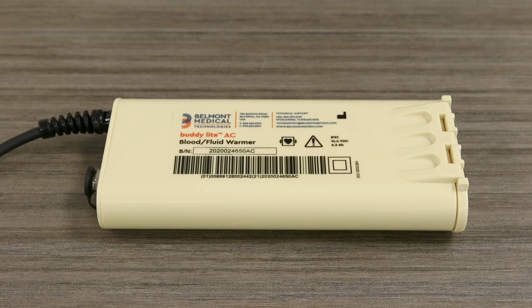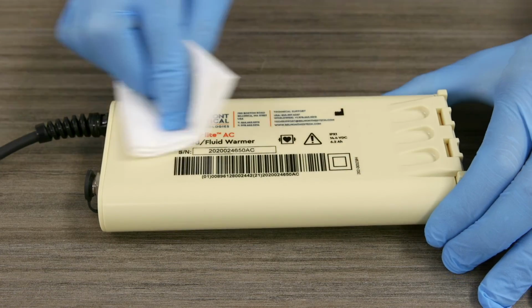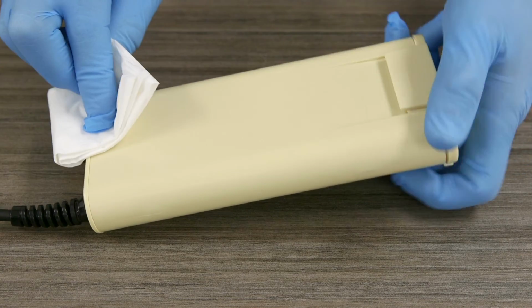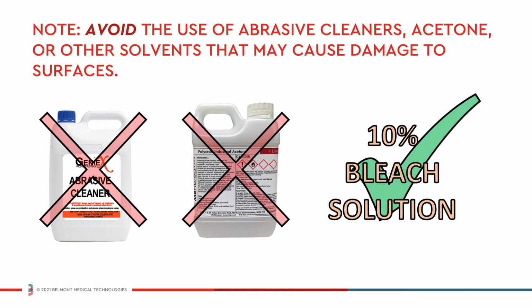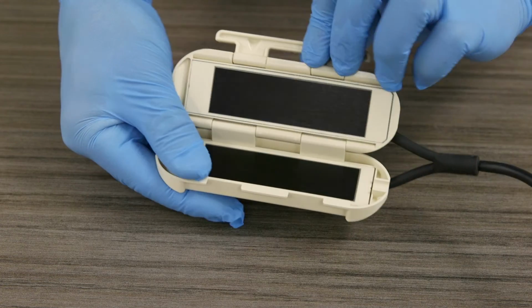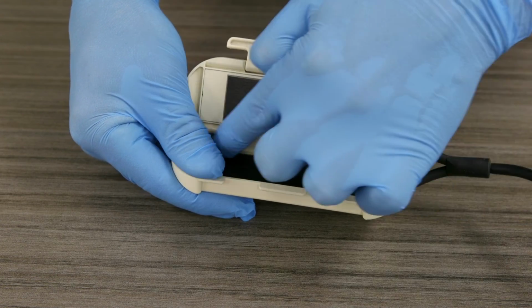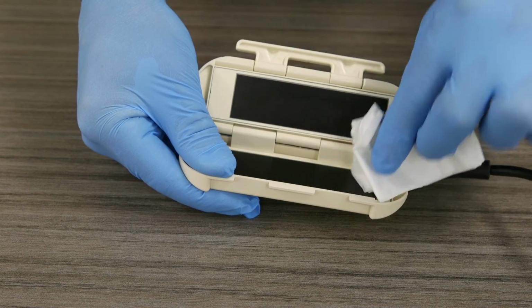Using a soft cloth with water, or with a 10% bleach solution, wipe down the outside surfaces of the battery housing, the power supply, and the heater unit. Note, avoid the use of abrasive cleaners, acetone, or other solvents that may cause damage to these surfaces. Open the heater unit and inspect the seal around the heater plates. If the seal is intact, wipe the heater plates with a 10% bleach solution and then dry completely.